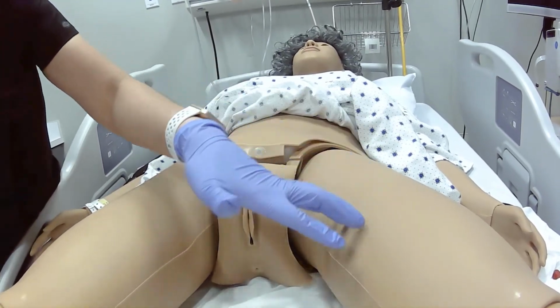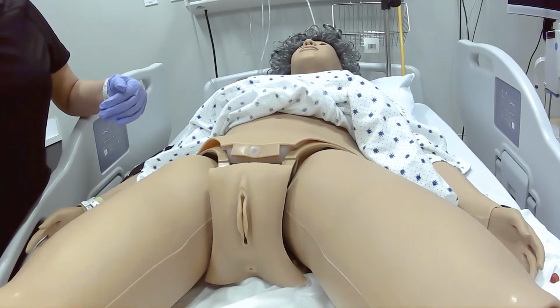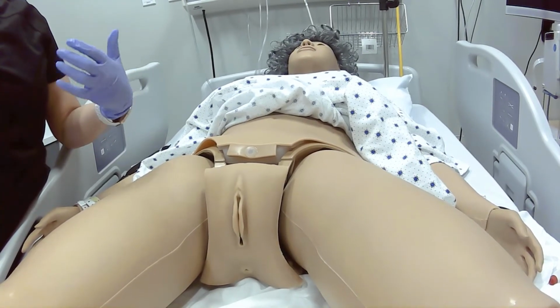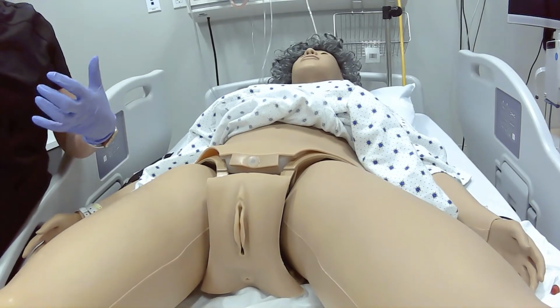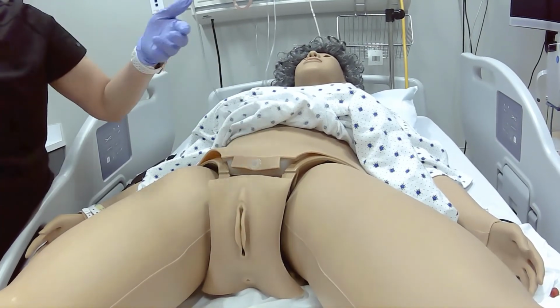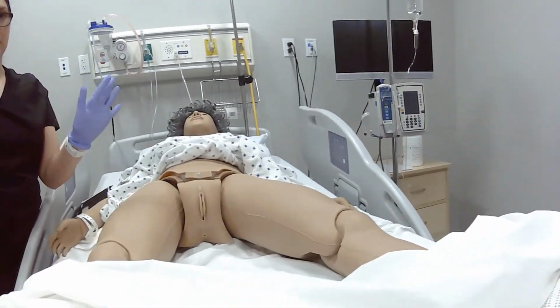So essentially you're cleaning this whole region, so you're getting rid of all that skin bacteria, whether it's healthy, normal flora or not, okay? Especially if your patient is not getting showers or baths frequently, all of that dirt, those microbes accumulate, so they can increase the chance of the patient getting a UTI with that skin flora in that area when we insert that Foley. Okay, so now we are done with the peri-care.